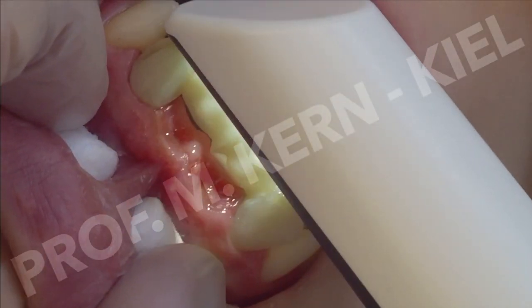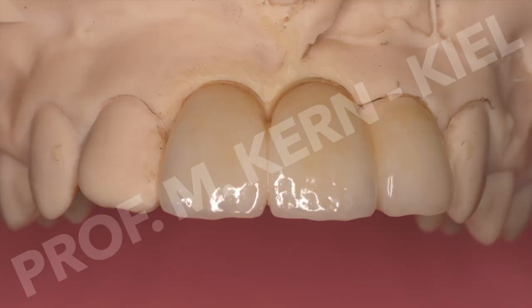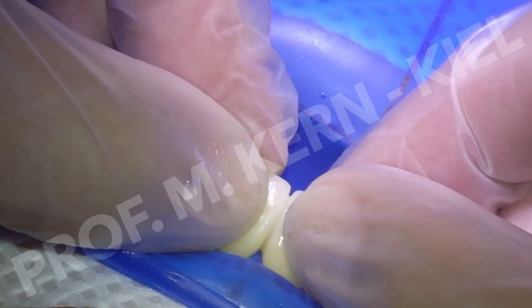Two weeks later, digital impressions were taken. The two pontics and the veneer were fabricated from lithium disilicate ceramic and fitted well.